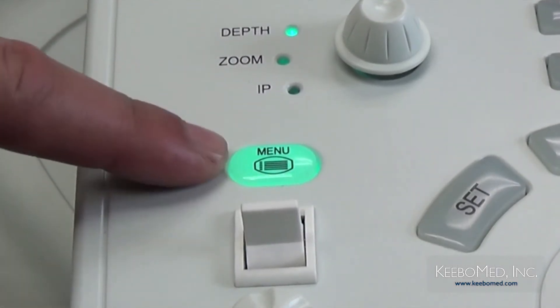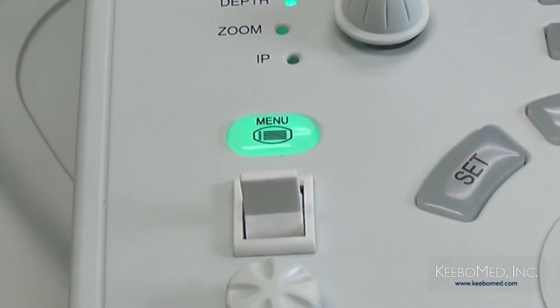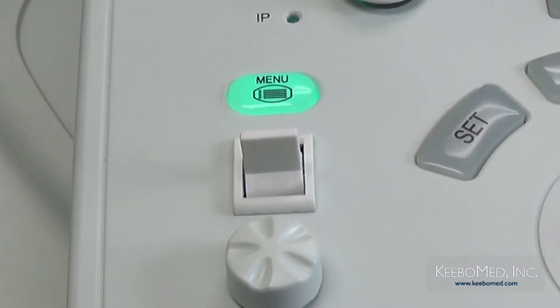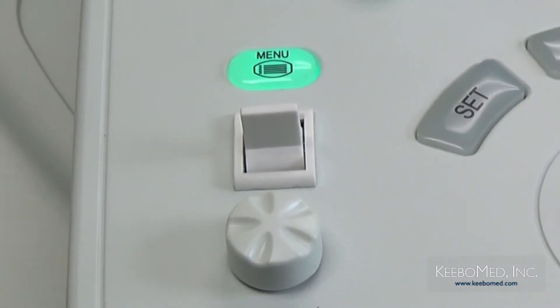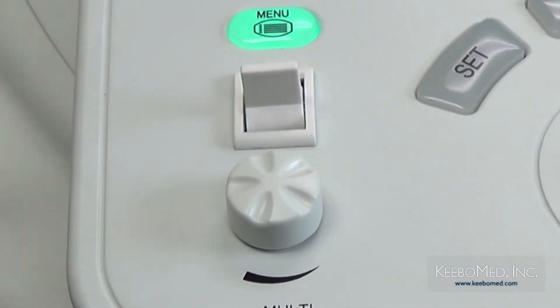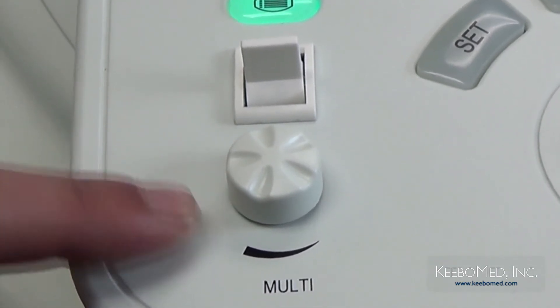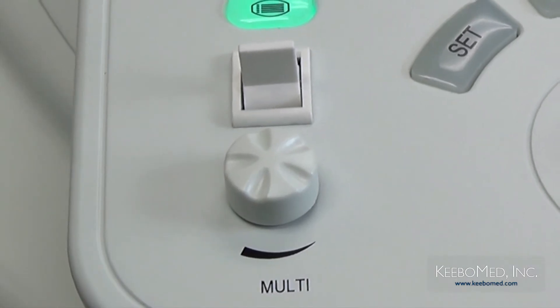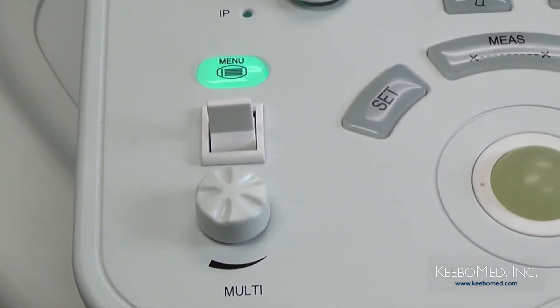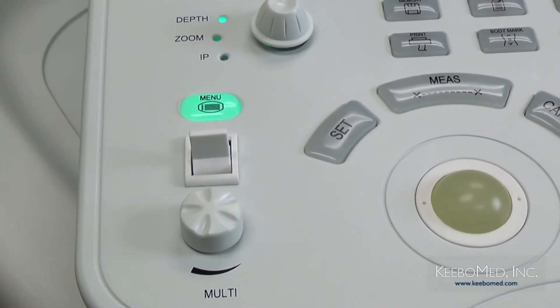On the lower left of the keyboard is a menu key. Pressing this key will display or hide the menu on the right side of the screen, and the key will be lit up when the menu is displayed. Below is a toggle switch key — moving it up or down will scroll through the menu items quickly. Under the toggle switch key is a multi-function knob, primarily used to adjust settings of parameters in the menu. For example, when frequency is selected, turning the knob will adjust the probe frequency up or down.